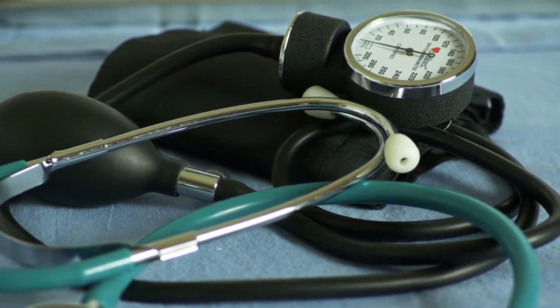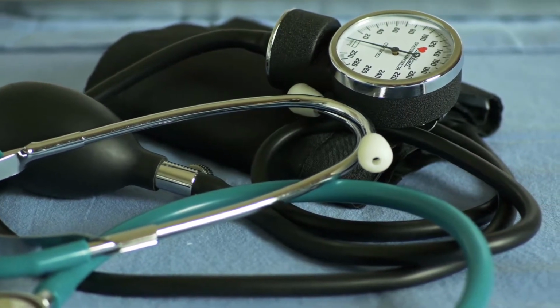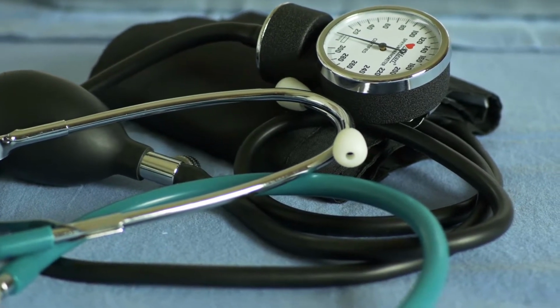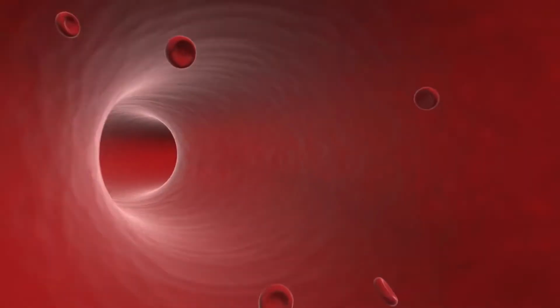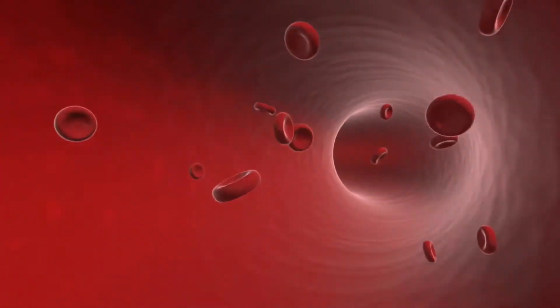What is a carotid artery Doppler? A carotid artery Doppler is a special type of ultrasound device that relies on the Doppler effect to determine the amount of blood flow through the carotid arteries. The carotid arteries are two arteries that reside in the front portion of the neck that are responsible for carrying oxygenated blood from the heart to the neck and the brain.